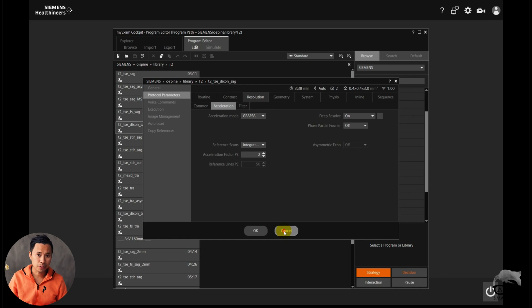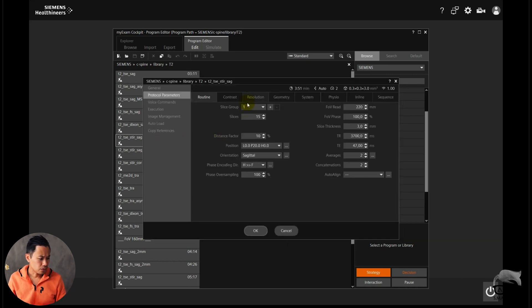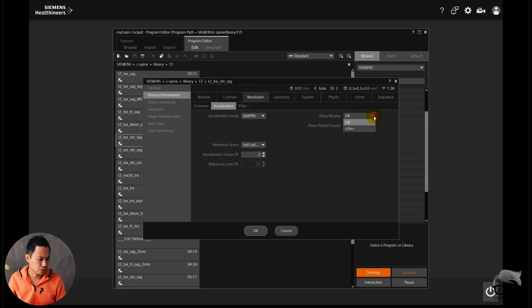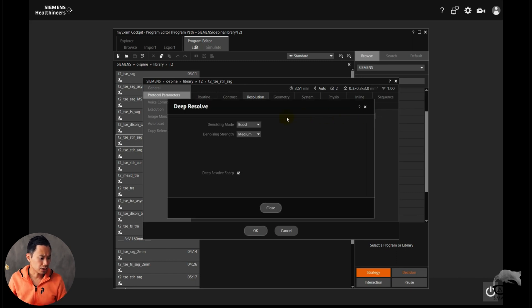Turn Deep Resolve on and you will get sharp images — it's as easy as that. Now let's look at a standard 2D Turbo Spin Echo — this is a STIR. Whenever you turn Deep Resolve on for the STIR, it automatically goes to what they call Boost, which is the newest one. And you have the possibility to choose the older versions: Gain and Sharp.